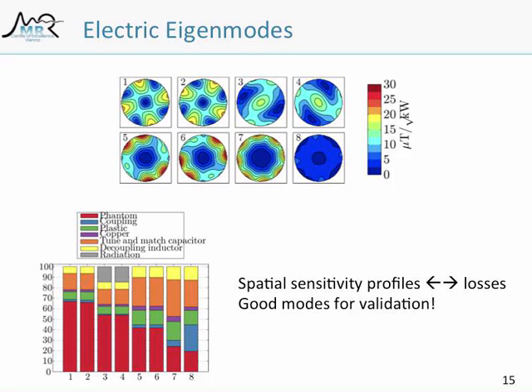But you always have the same power going into the coil. So you always put 1 watt into the coil. And nothing is really changing with the matching.